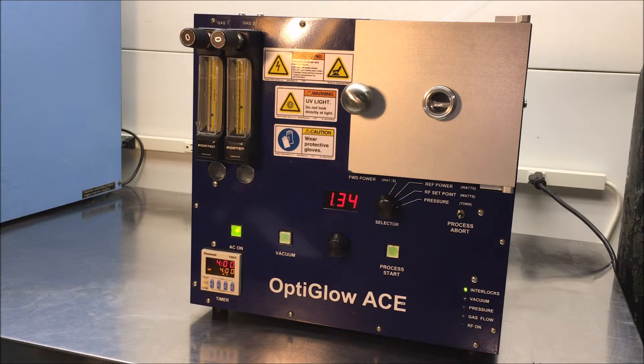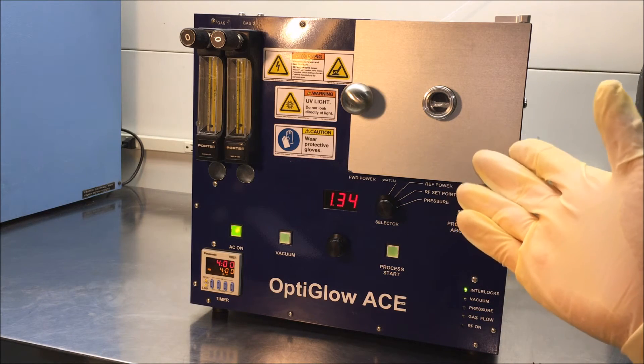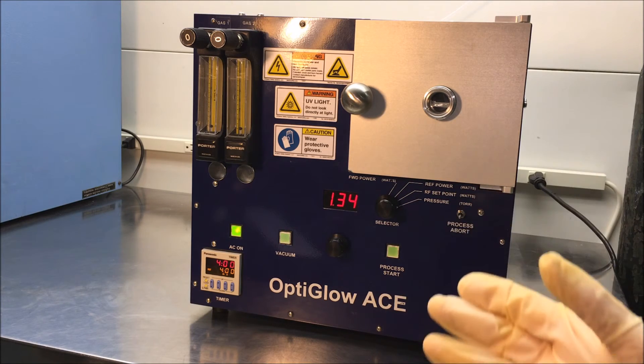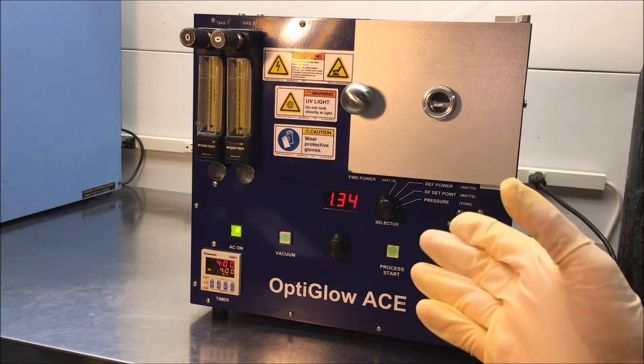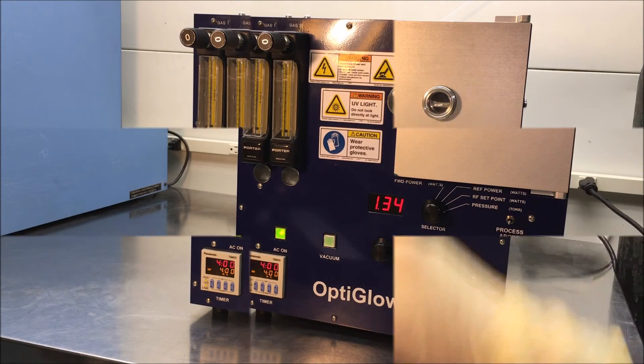That will close the vacuum valve and now that's allowing the system to vent back to atmosphere. The system has a prefixed orifice that allows for a softer venting of the chamber. So if you have light things in your processed chamber, such as maybe light samples or feathers or something of that nature, it won't disturb them. After you wait about a minute and a half, you should be able to open this front door right here.